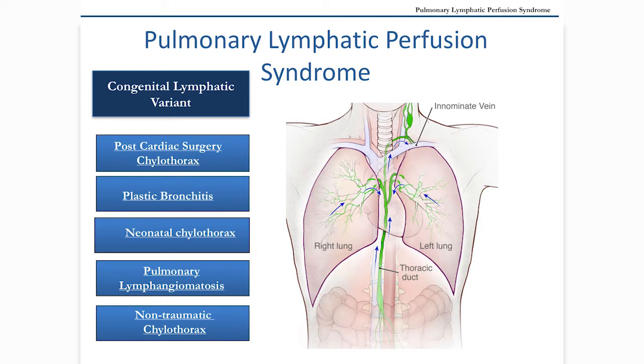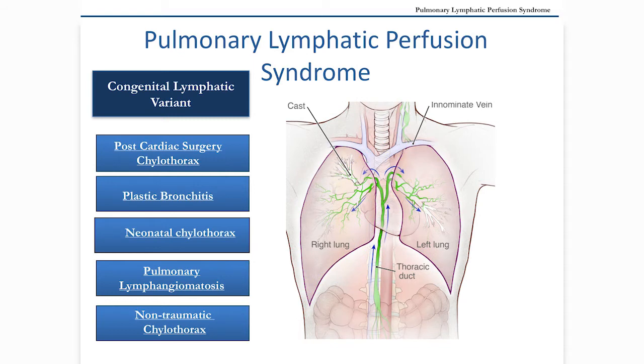On the left, you can see the list of all different diseases, not complete, that actually have this anatomical substrate as a disease process. So what is that?